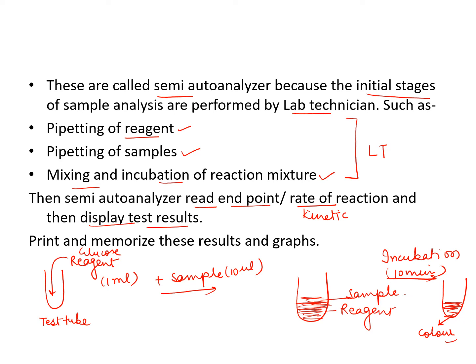So half the function is done by the lab technician and half the function is done by the machine. Okay, pipetting of reagent, pipetting of sample, mixing of reaction mixture, and incubation. These steps are done by the lab technician, and then reading, then display, then printing, and then memorizing. These are done by the machine. So that is why this is called a semi-auto analyzer.